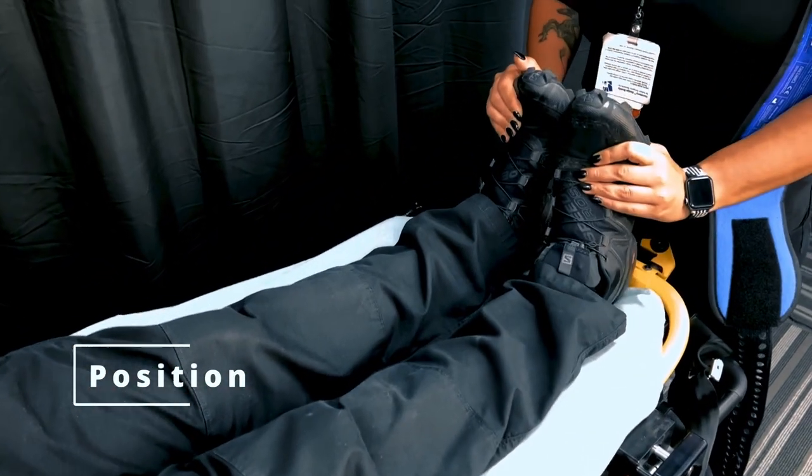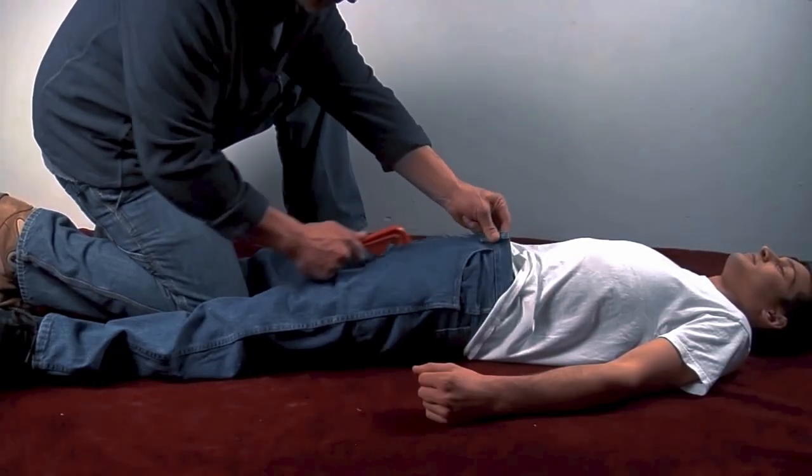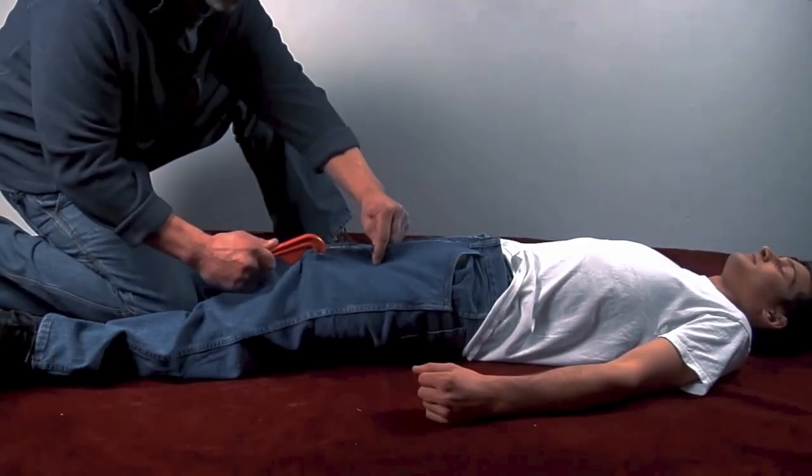First, position the patient on their back with their legs straight and together. If the patient is wearing clothing, cut or remove any clothing that may interfere with the placement of the pelvic binder.